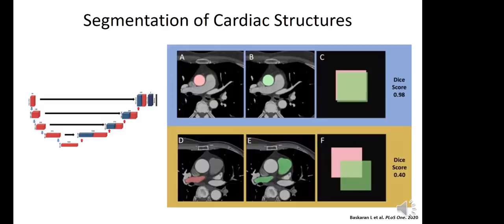Coronary computed tomography angiography differs from routine calcium scoring in the fact that contrast is given, which makes blood bright and hence enables the physician to evaluate the inside of a specific structure as well as the wall and surrounding structures. Coronary CTA allows for the assessment of the coronary arteries, but a lot of other structures are often visually assessed for disease or enlargement, as quantitative assessment can be very time-consuming and not practical within the existent framework of practice.